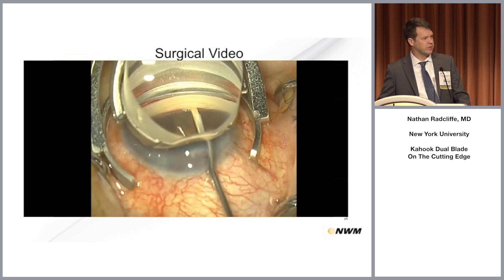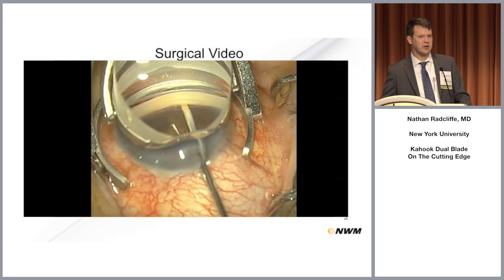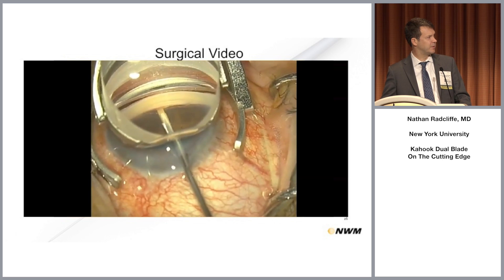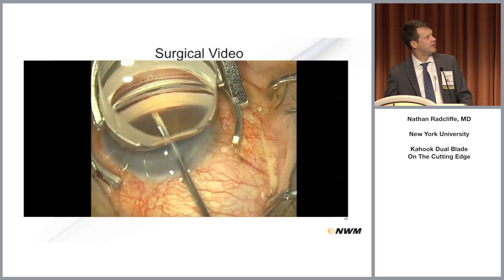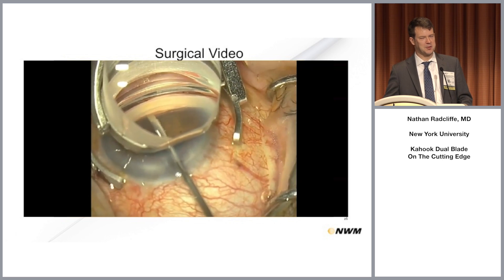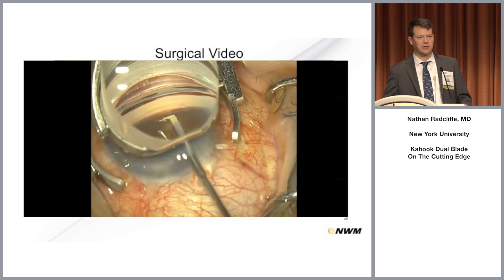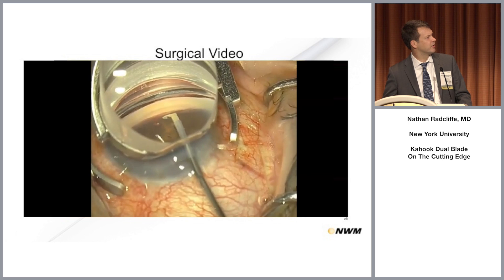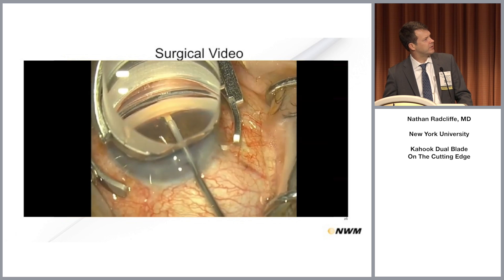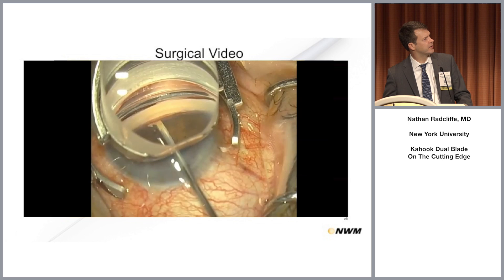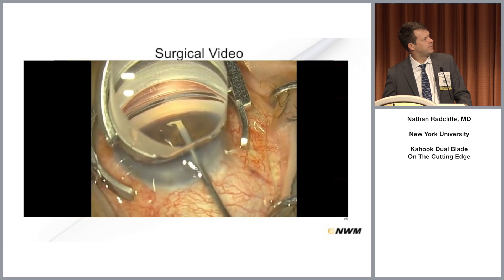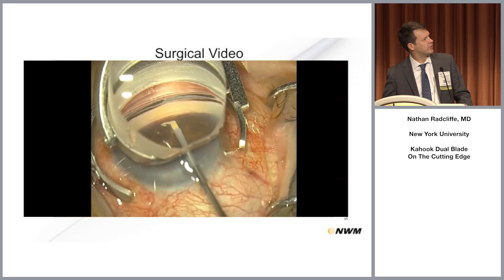The Vold gonio lens can help you move or stabilize the eye. The warning is that patients can feel a Thornton ring, so if they're not blocked you'll want to apply a little topical anesthesia. Here we are engaging the angle with the dual blade.